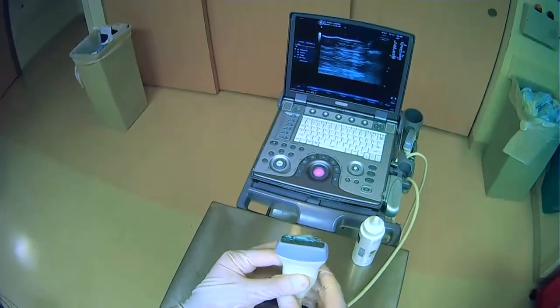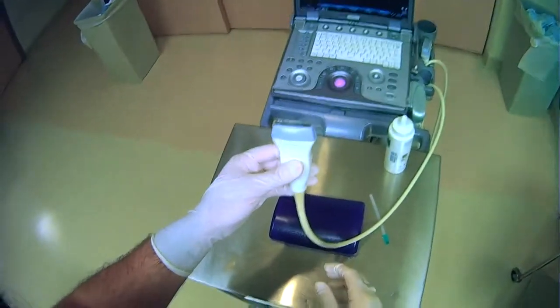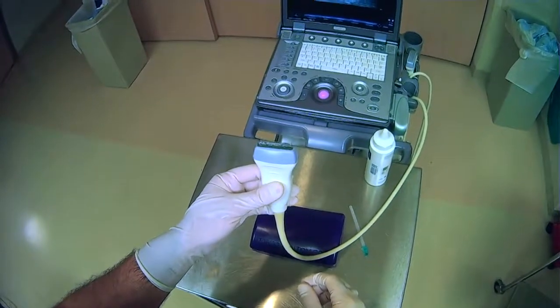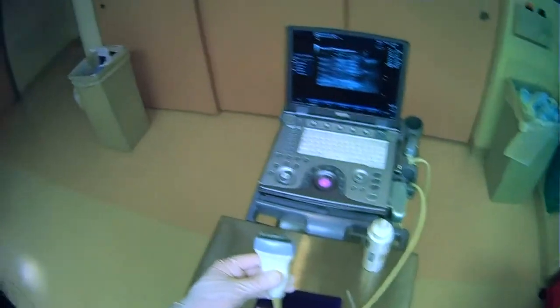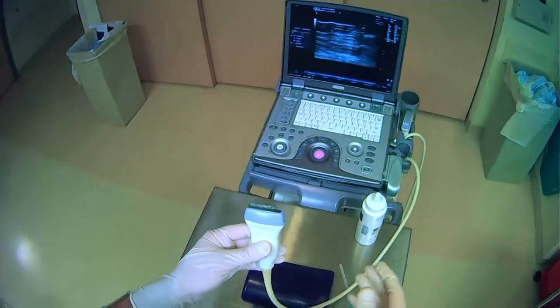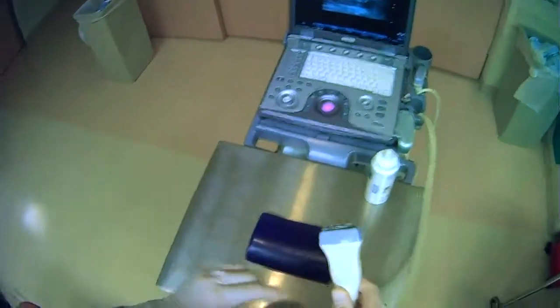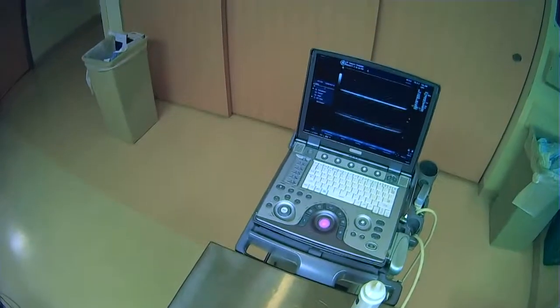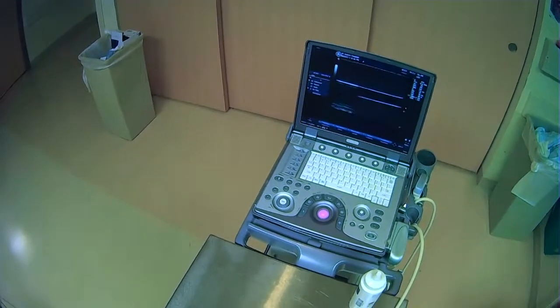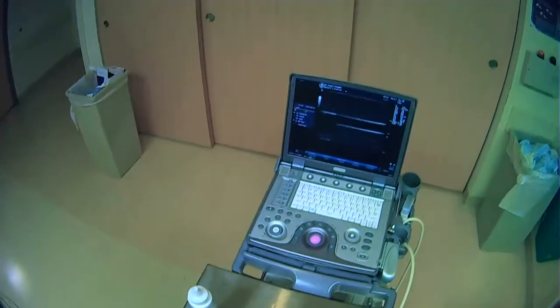This is very important when you start doing your procedures, because you will need to keep in mind the orientation of the probe and the screen when you're repositioning pretty much anything. As you place the probe on the patient or on the model here, we have kept our alignment.